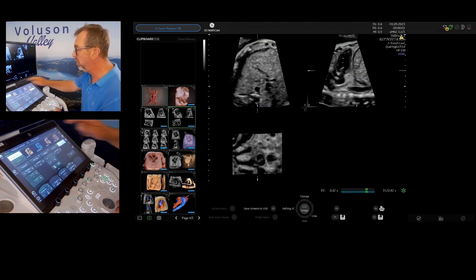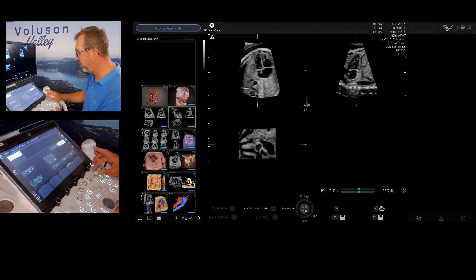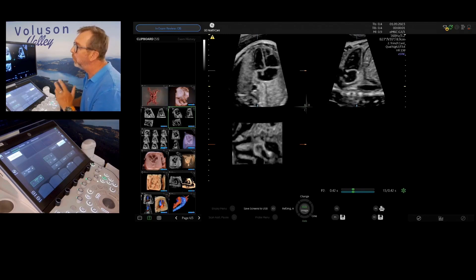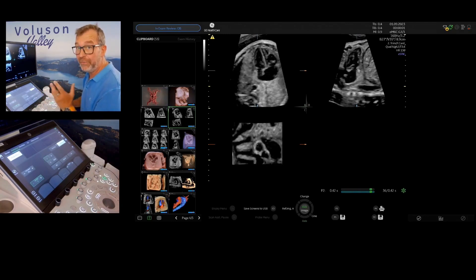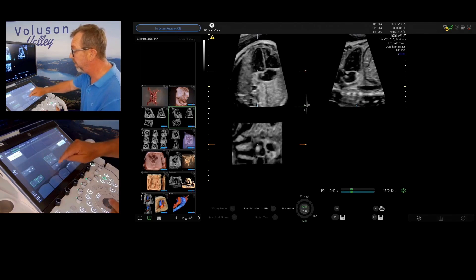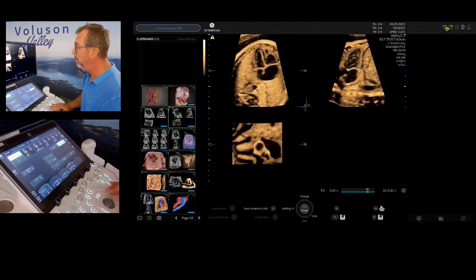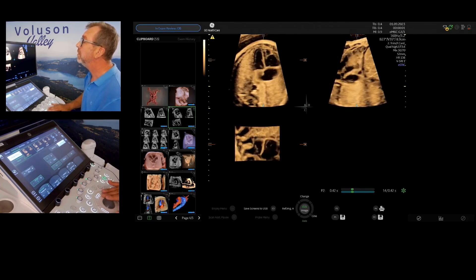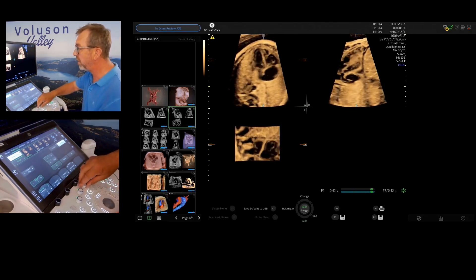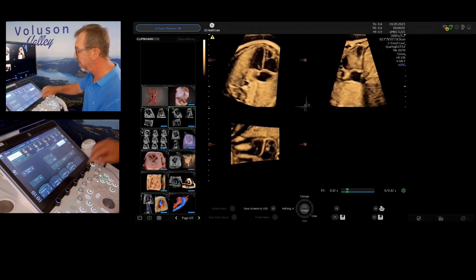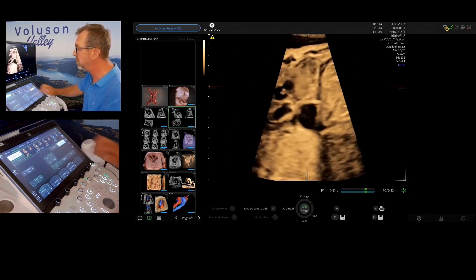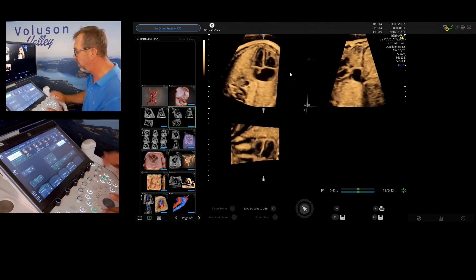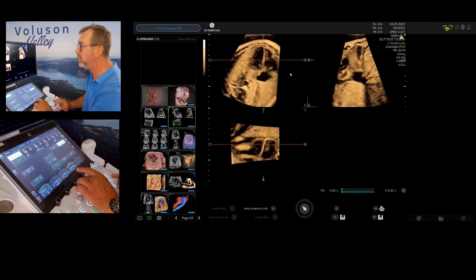Back to multi-planar with the INIT button. We can show the septum in a very simple way: activate the VCI, place the dot in the A plane on the septum - similar to the aortic arch technique - then rotate around the Z axis. Immediately in the B plane you can see the complete septum. Imagine if there were a VSD - this could be visualized immediately.